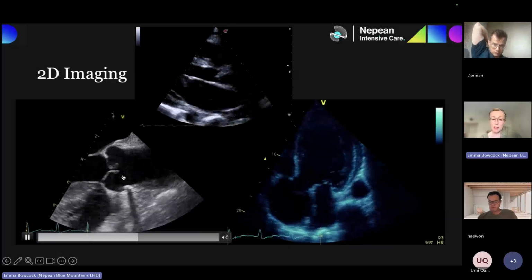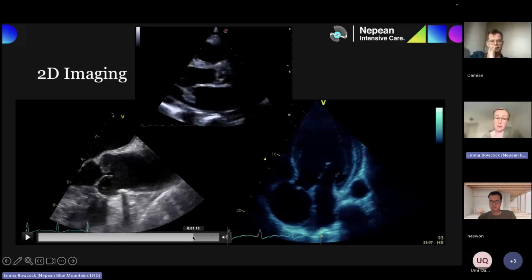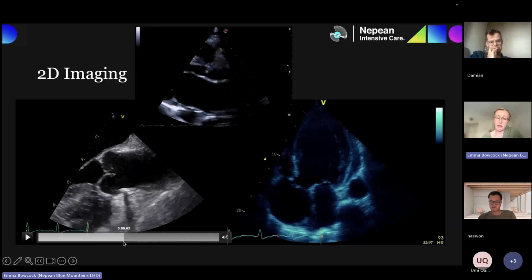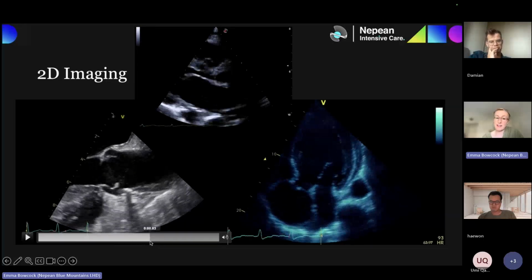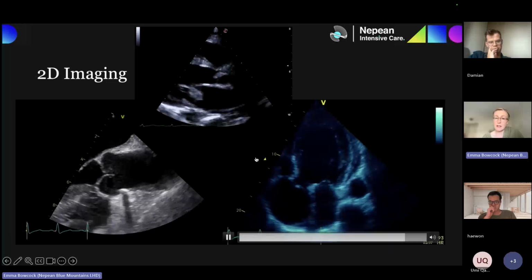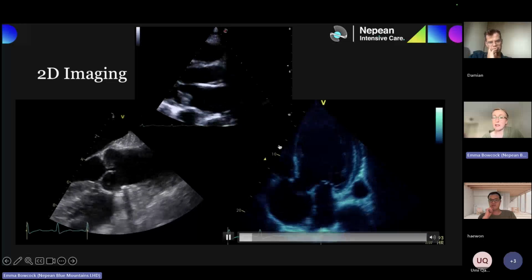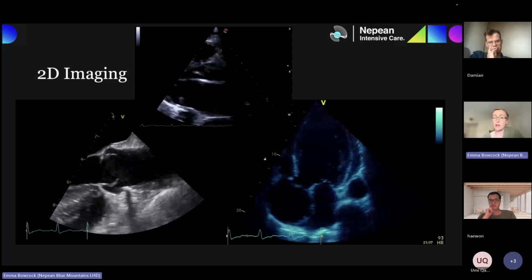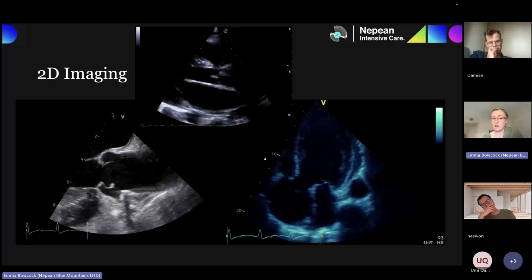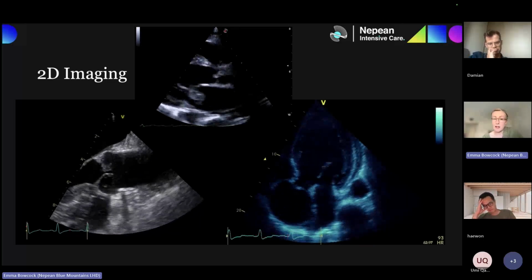And what we can see down here is what I was talking about with that systolic doming. So this is a patient we had with rheumatic heart disease, with restriction of the leaflets. Can you see how there's doming of the leaflets in systole? It's actually quite nice. Obviously up here we have a big 2D defect of both the aortic and mitral valves with huge vegetations there. So we'll be expecting to see severe valvular regurgitations associated with those.